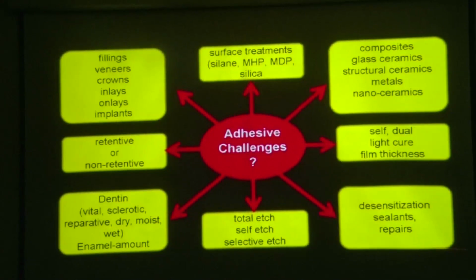And then came the new technique that's called selective etch, where you selectively etch only the enamel, wash it off, rinse it, air blow, and then apply self etch. So I'm going to use two different systems on a single tooth. So that way I'm going to get good marginal integrity on my enamel.